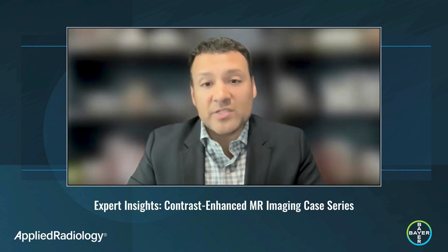I'm currently using EOVIST in the differentiation of focal nodular hyperplasia from adenomas, the evaluation and follow-up of patients with both hypovascular and hypervascular metastatic disease, and also in the pretreatment and post-treatment assessment of patients with metastatic liver disease.